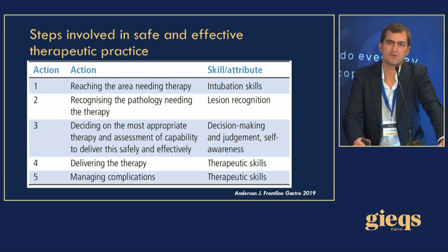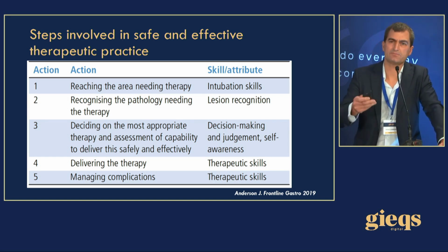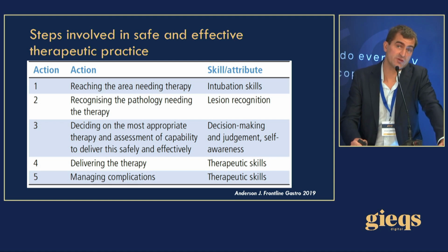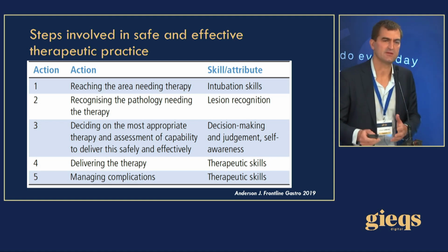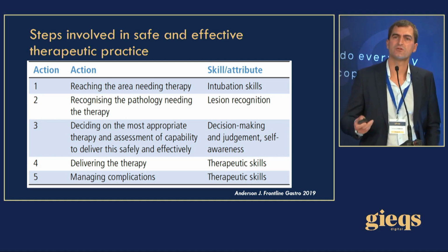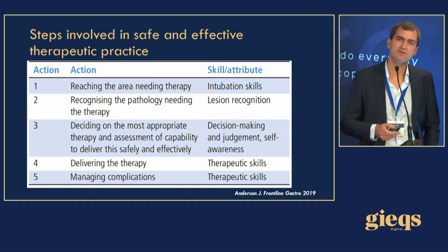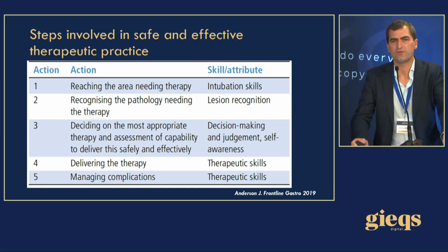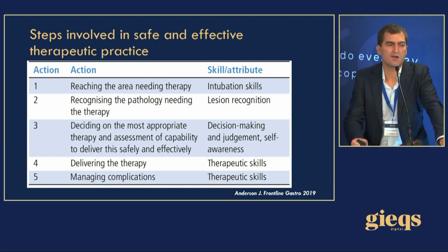So, written by Dr. Anderson recently, these are the steps involved in a safe and effective therapeutic way of progressing. So first action needed is, of course, to reach the area needing therapy. So it's based on intubation skills. The second point is to recognize the lesion, of course, and to know which lesions need a therapy and which kind of therapy is needed. The third one is about decision-making and judgment. And the fourth and fifth ones are therapeutic skills, like the delivery of the therapy and managing complications.